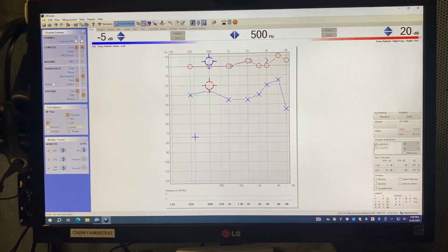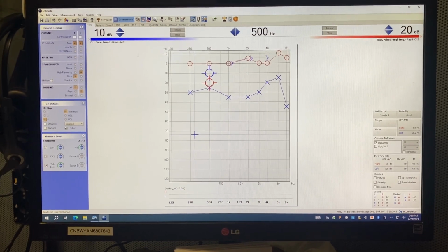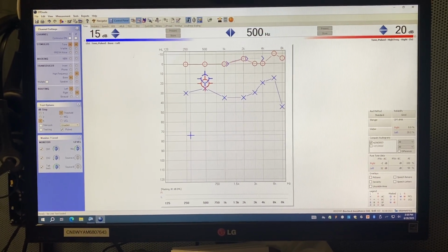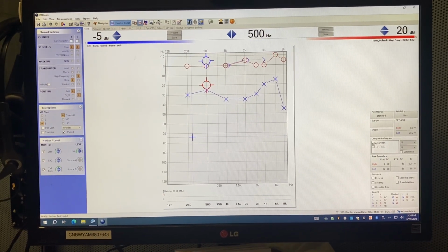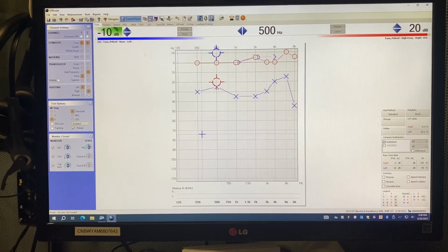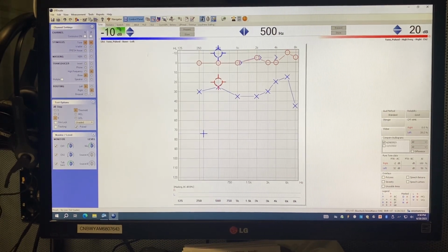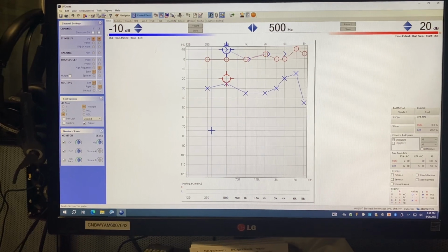We're going to go all the way down to 500 hertz. And we are going to familiarize. This is a much different tone. Lower intensity 10. Lower intensity 10. Can only lower 5 there. Okay, we're going to take it.